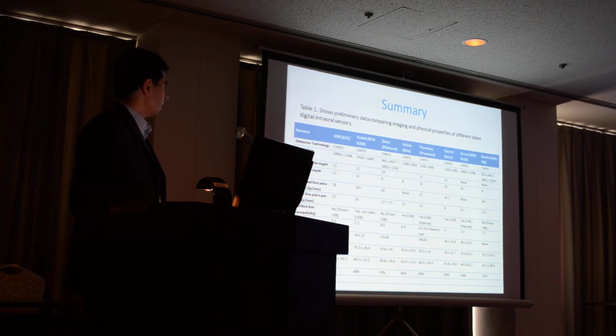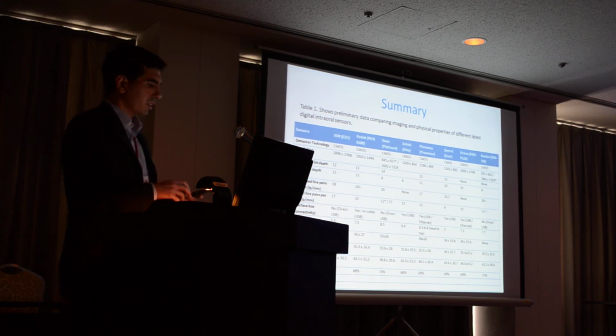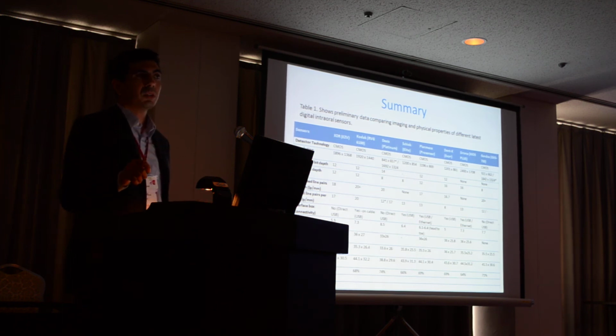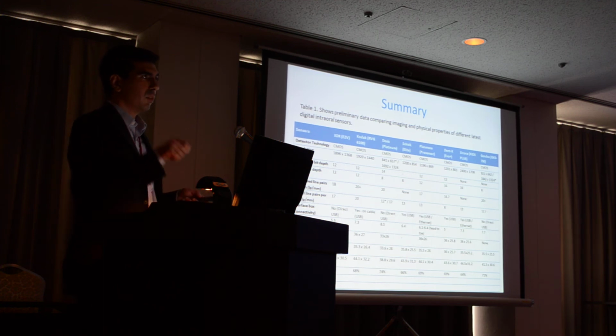Denix, you get 8. Some sensors come either as direct USB or they have an interface box to connect to the sensor. So we listed that here. Planmeca and Sirona have an Ethernet option, so you can plug the sensor directly to the network rather than to the computer itself.